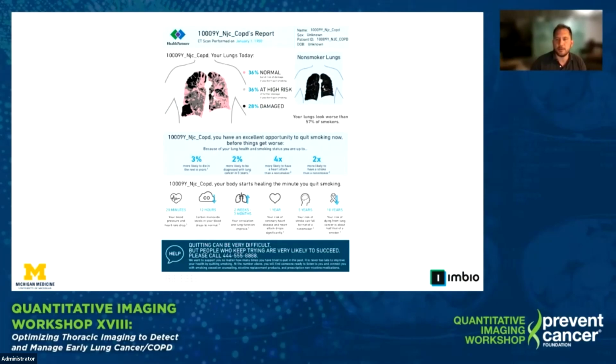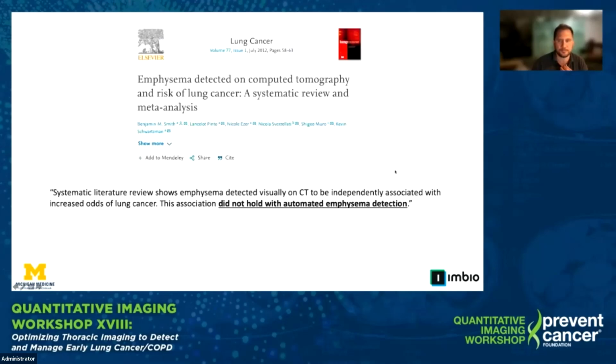It is based on the health belief model for improving the likelihood of adopting a behavior, in this case, quitting smoking. In this personalized report, low-density areas on a patient's lungs, as detected using automated software, are displayed on the report, and their percent low attenuation area is compared to results from the NLST study. The benefits of quitting and a helpline are then displayed on the bottom of the page.